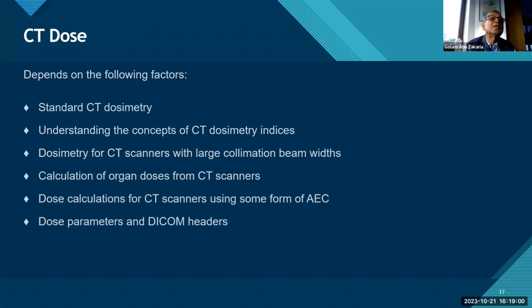Here the dose: a physicist is always with dose, but CT dose is defined somewhat differently than in normal dosimetry. Here you see the term you have learned, CTDI, computed tomography dose index. You understand what this is, and of course there are many terms associated with CTDI. From the CTDI you can calculate the DLP, the dose length product. CTDI is only one slice, and when you have the area of the body, you can calculate the DLP, and from the DLP you can calculate the effective dose.